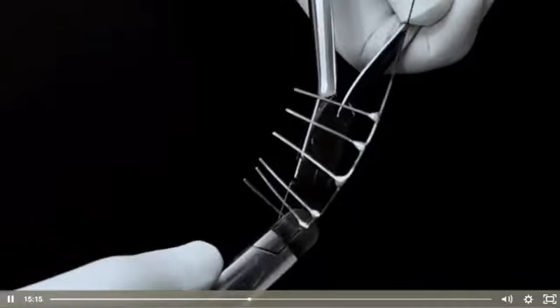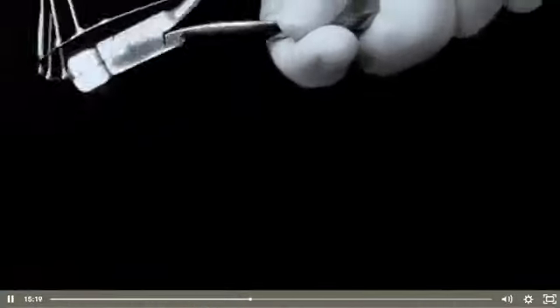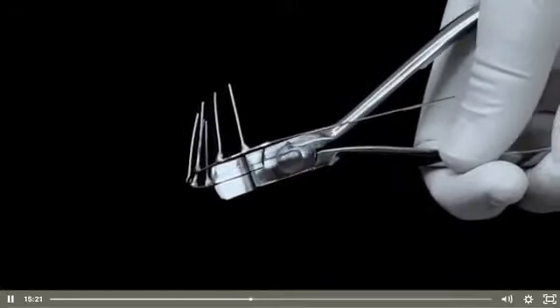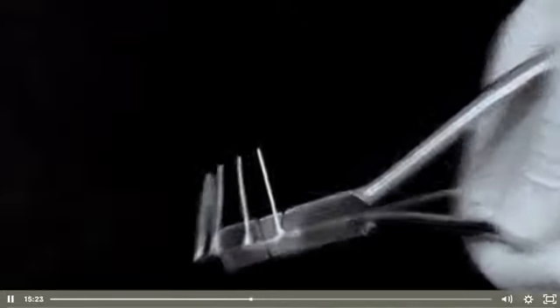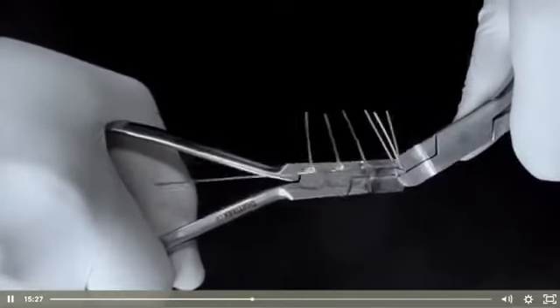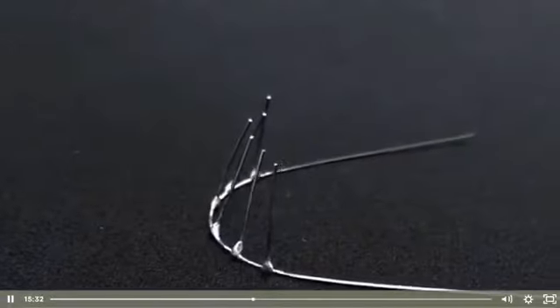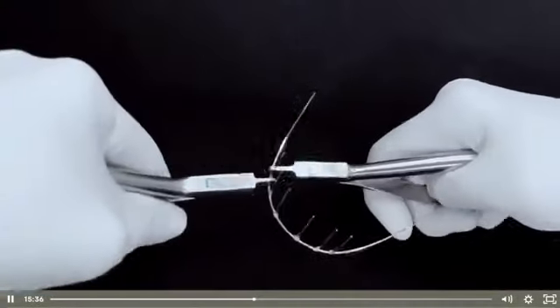So now this is the way I apply the torque to neutralize the posterior segment. I grab the wire with two pliers, in this case two Tweed pliers, one close to the other, and I rotate, untwisting the posterior segment to have the neutral torque in the posterior segment. And now we see that we really have a torsion.